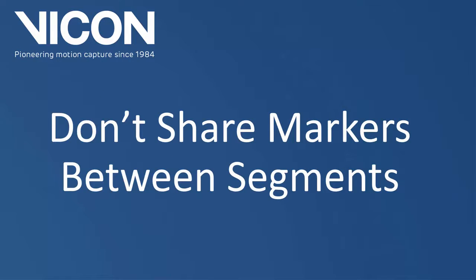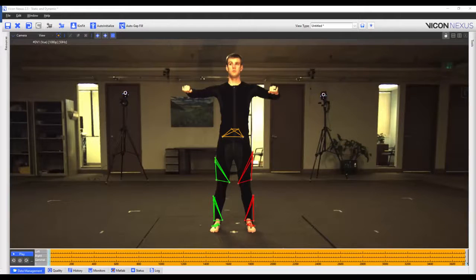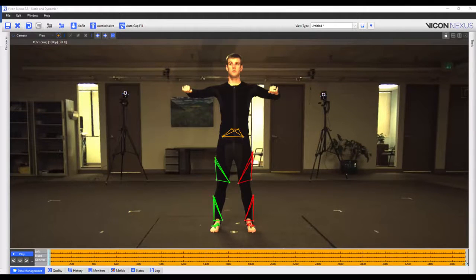The second rule is that we don't share markers between segments. I could create a VST for the full body, but for the purposes of this video, I'm going to focus on the lower body only.